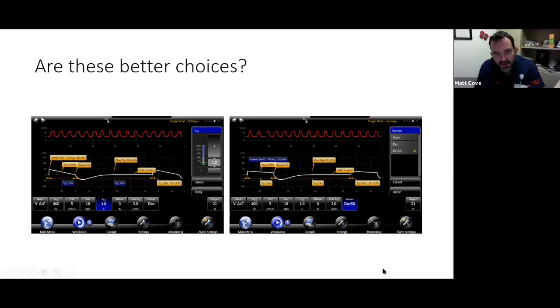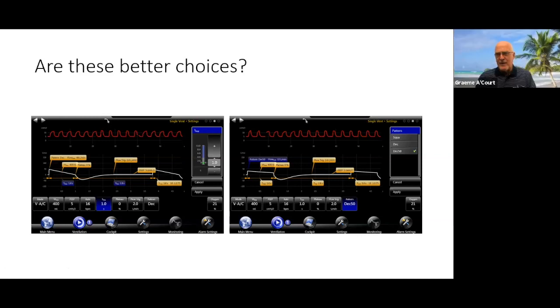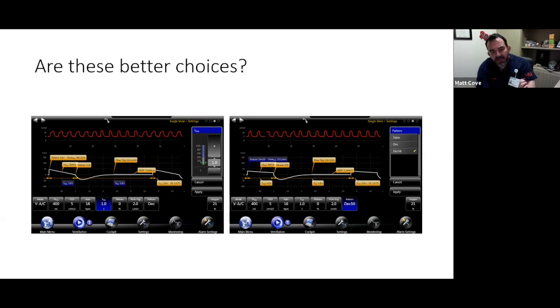That's interesting. That's not something we would normally think about, actually. That's right. I don't even know on our ventilator if we can modify the deceleration rate or how far it decelerates to. I'm not even sure. I've not seen that as a modifiable option. All I can do is hit the waveform and choose, looks like square wave or decelerating. Yeah.